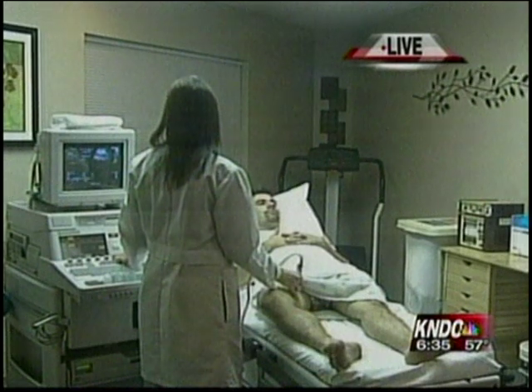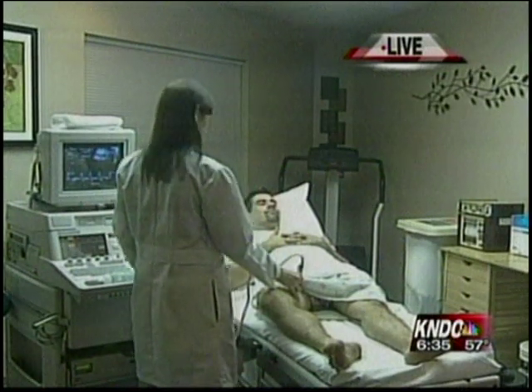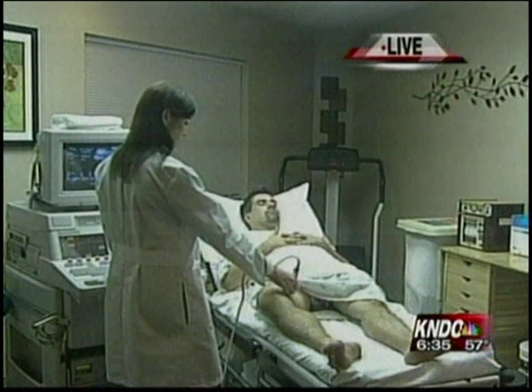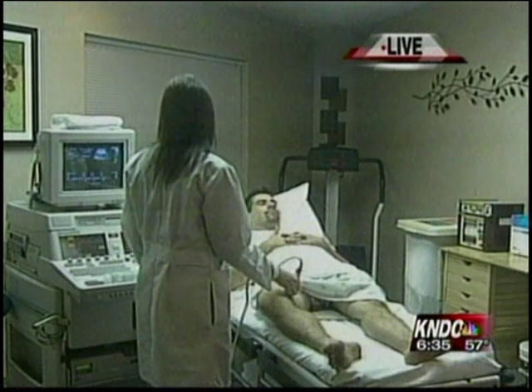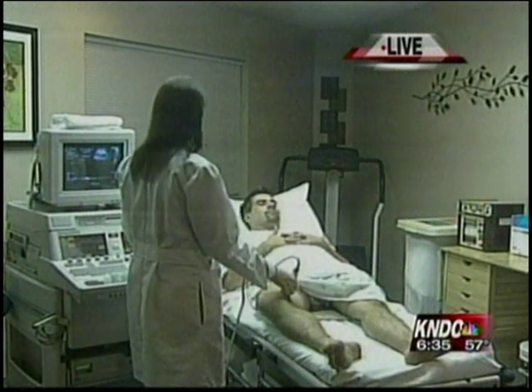And as the plaques build up inside the artery and narrow down the artery, the blood has to squirt through faster in order to get down to the foot. So as it goes faster, we can measure that, and we know that at certain speeds there's a certain amount of narrowing in the artery. So if it gets very narrowed, the blood is squirting through extremely fast.